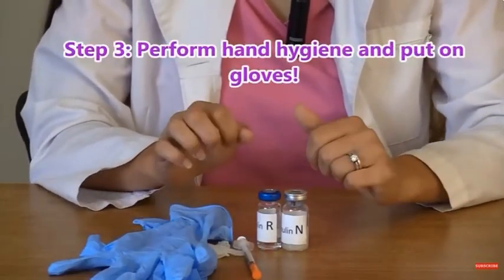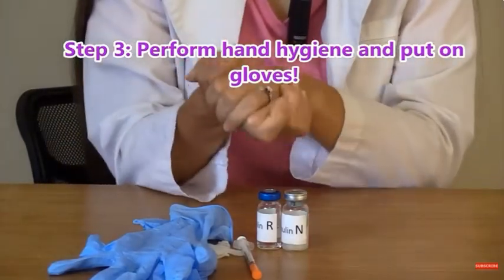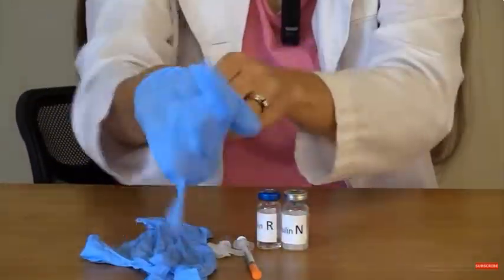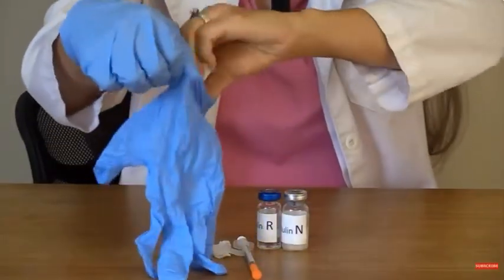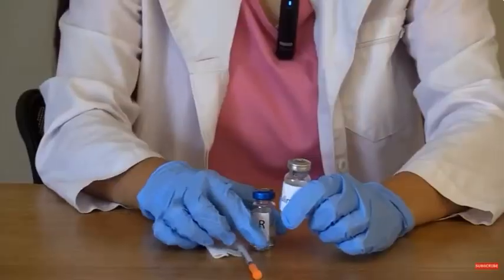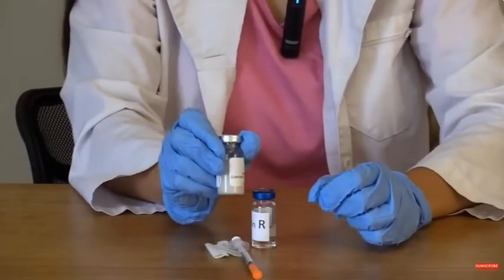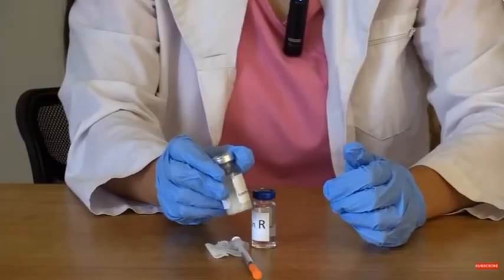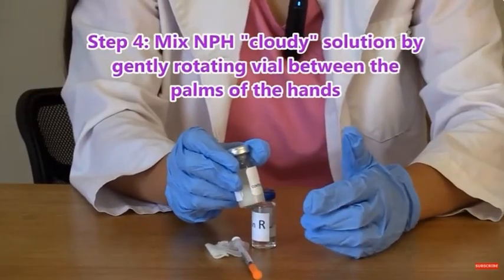Next, we're going to perform hand hygiene, clean our hands, and put on some gloves. Then we are going to take our cloudy insulin. It's the NPH, the intermediate insulin, and we need to mix it because it likes to settle.